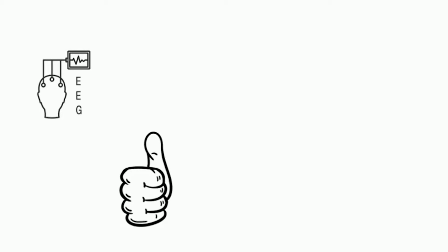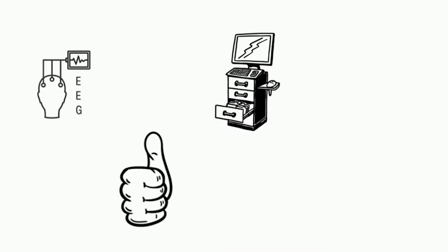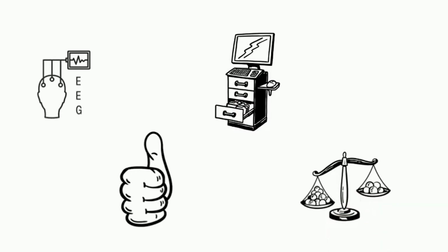The results will be compared to medical databases to indicate which activities are pronounced stronger or weaker in comparison to a healthy person of the same age and gender. Thereby, imbalances in brain activity can be shown. Based on these results, an individual training protocol will be constructed.